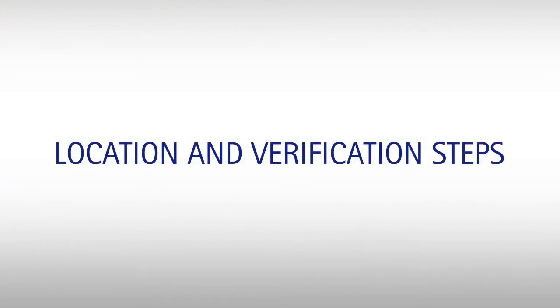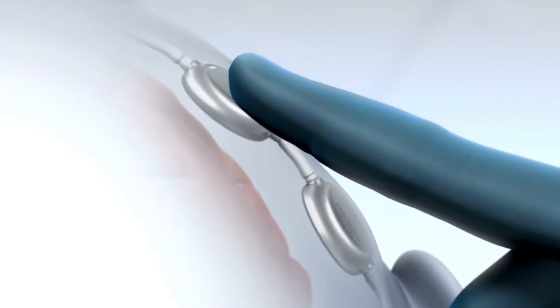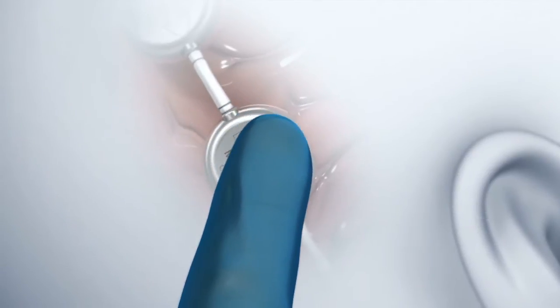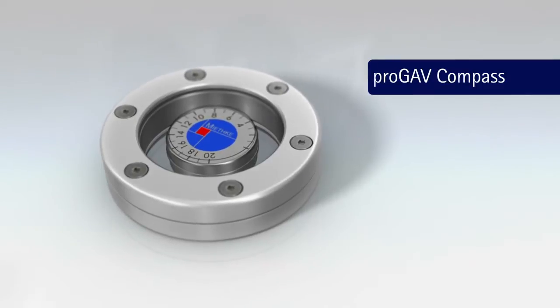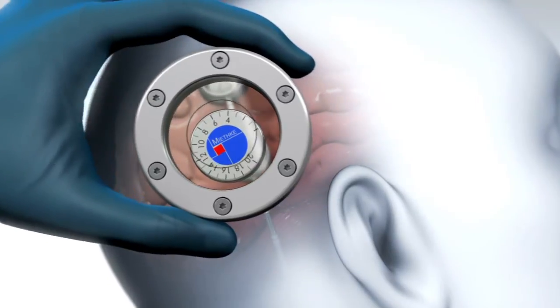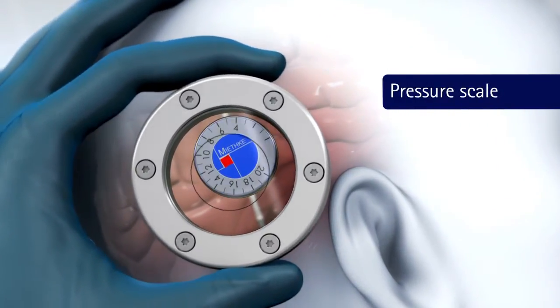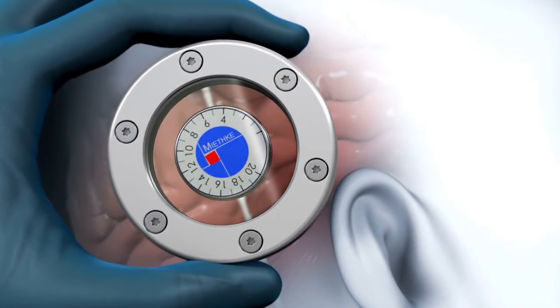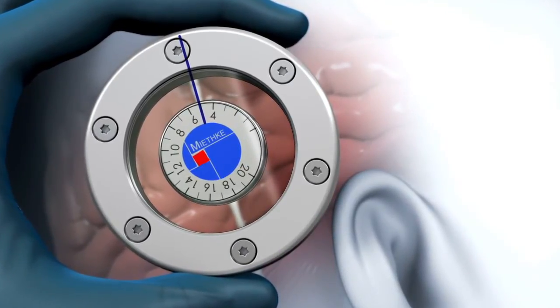ProGav can be adjusted according to the following steps. The valve can be located through palpation, starting at the reservoir or proximal catheter and moving downward, or by using the ProGav Compass. Place the compass over the skin and rotate it in a circular motion until the pressure scale remains centered and stationary within the ring. Verification of the current setting will be reflected by the number on the pressure scale that is aligned with the reservoir or proximal catheter.